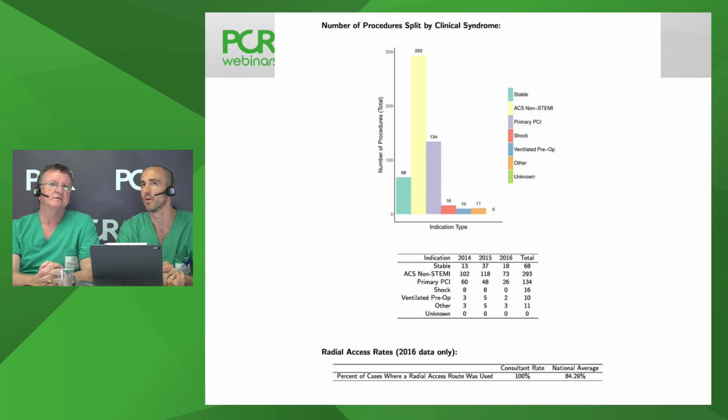In our institution, we have 11 operators, and 10 of the operators do 95% of their cases radially, and one operator is probably 50-50. Now, this is my own personal data. In the UK, we have to submit details of every case to the Interventional Society. It's collated centrally and then published on an open access Interventional Society website. You can see there that my own personal radial rate for that year was 100%. That is unusual. I wouldn't expect that to be repeated, but certainly 95%, good, I think. So we're going back to the cath lab to catch up with the case now.